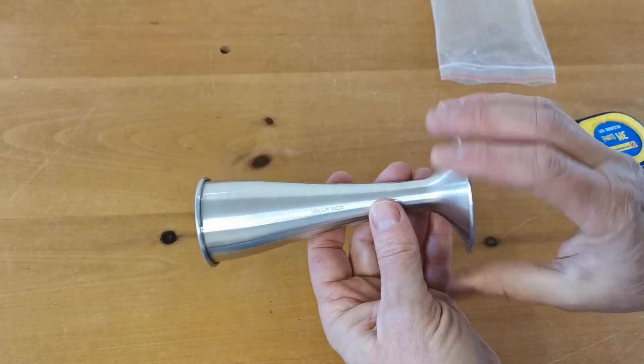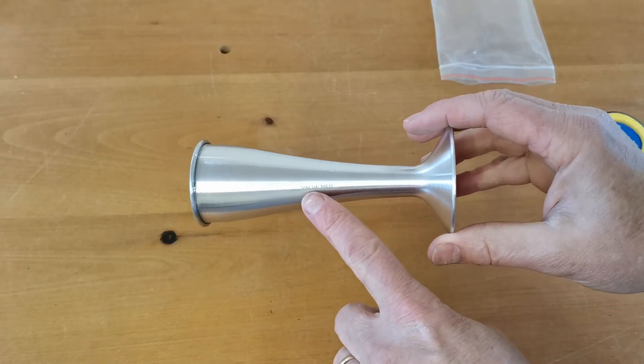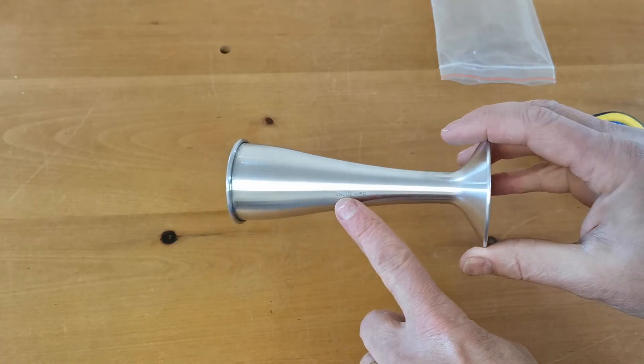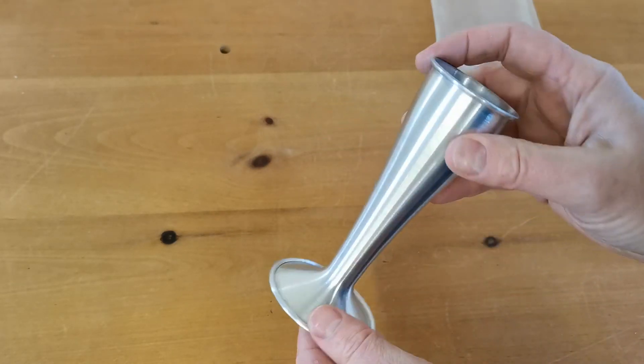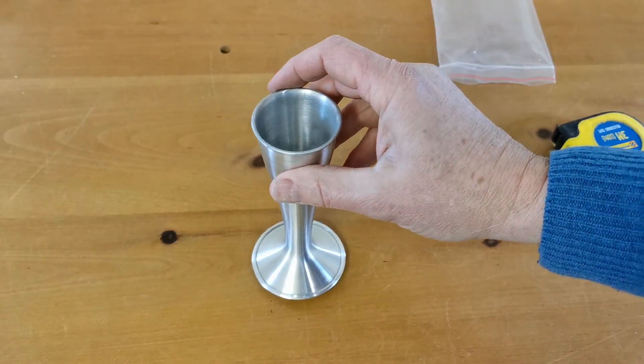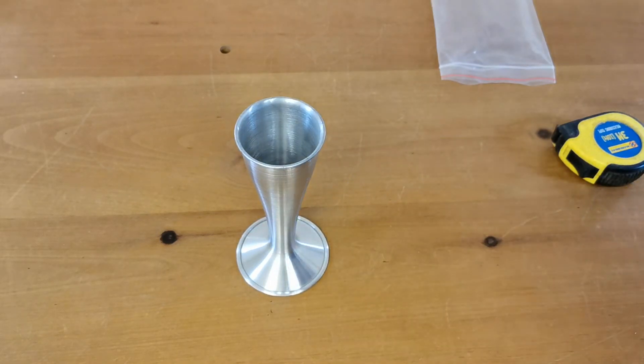It's a brushed or turned aluminium finish. These units are very discreetly branded with the Valumed logo on the side, but are very clean, easy to wipe down and sterilize — fully autoclavable. Nice and robust, very light.